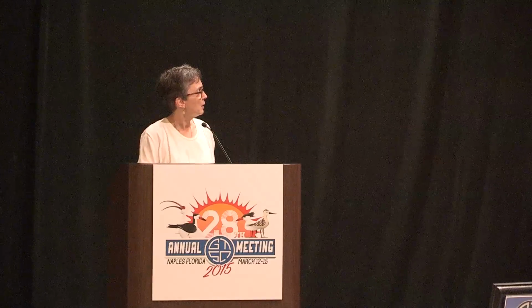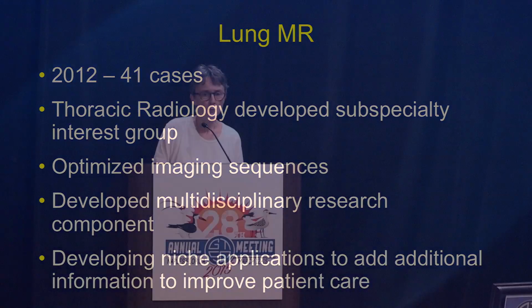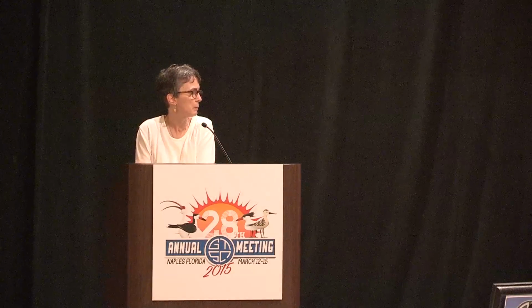So at Mayo, in 2012, they went back at the end of the year and looked at all their lung MRs and said, how many are we doing? They did 41 cases all year, and that was like 0.3% or less of all the MR studies that were done. So a very small fraction, and they looked at those and thought some of them had been mistakenly ordered and they really didn't want a lung MR, they wanted something else.